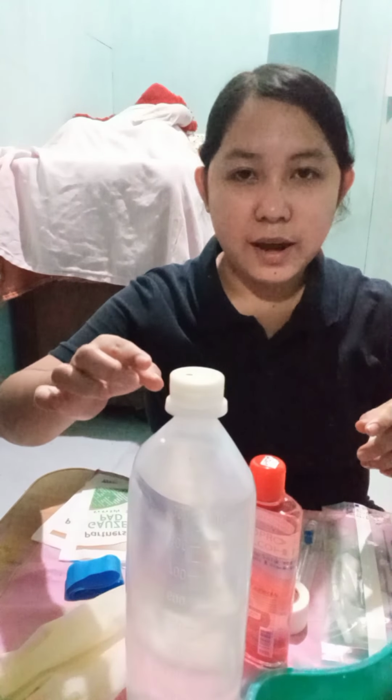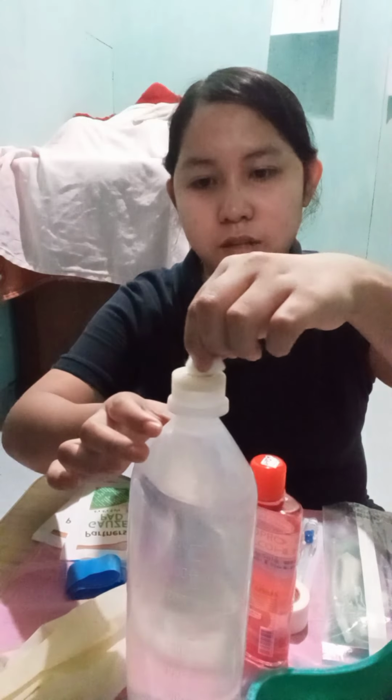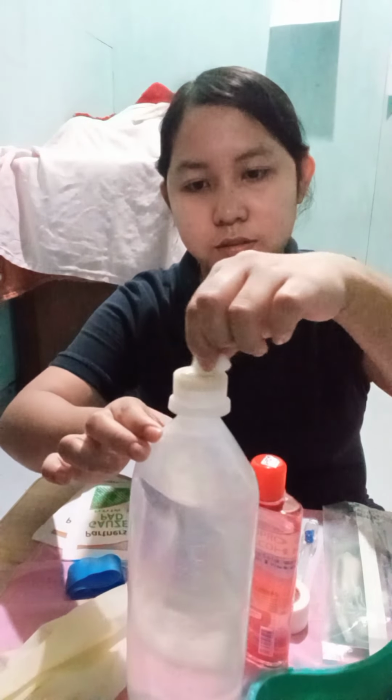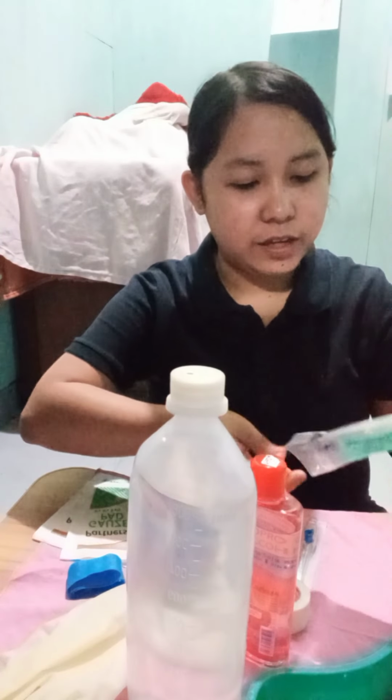After we open our IV fluid, clean with cotton balls with alcohol here, then dispose. Open the infusion set.